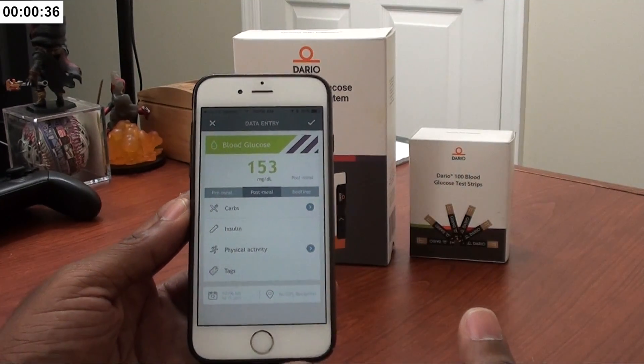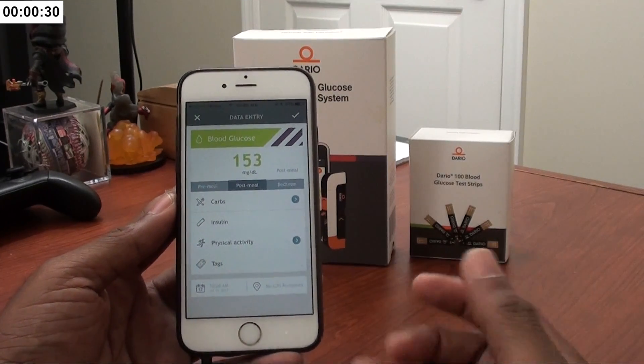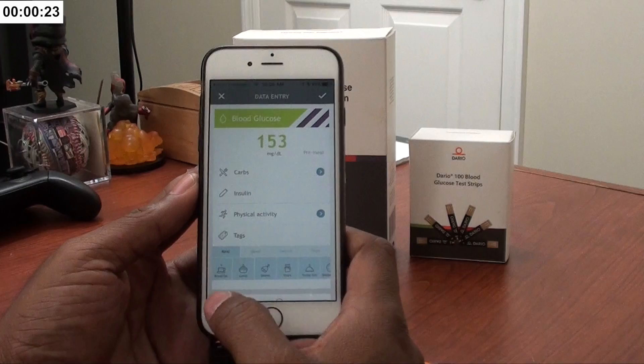You can go back and see what you've done for the week and what you need to adjust to get your numbers where they need to be. Let's say it's morning time — before breakfast. I'll do pre-meal, come down here and tag it as breakfast.